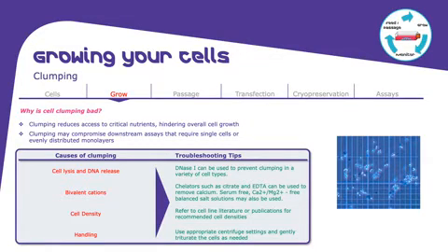The cause of clumpiness can be different. Either there's cell lysis and DNA release, and in that case you can add DNase I to prevent it in some types of cells. It can also be due to bivalent cations, so citrate and EDTA can be added to remove the extra calcium which might come from serum or other balanced salts.